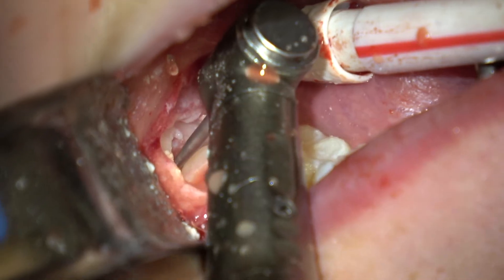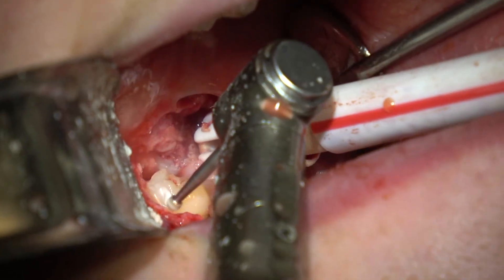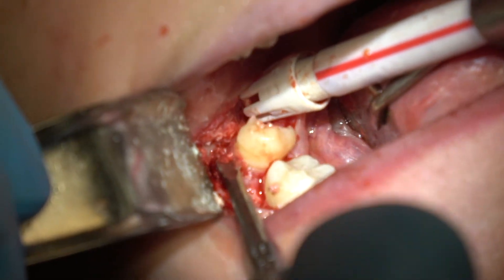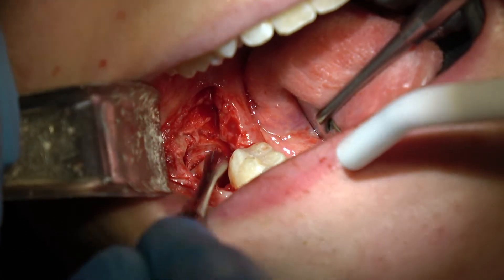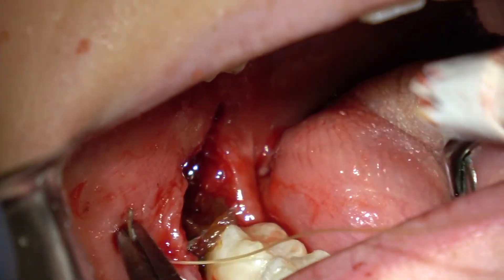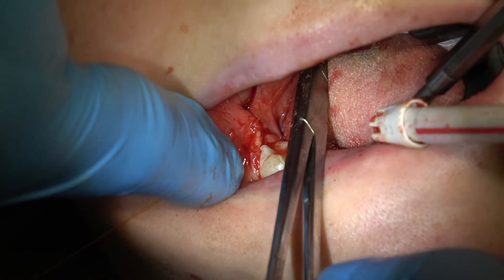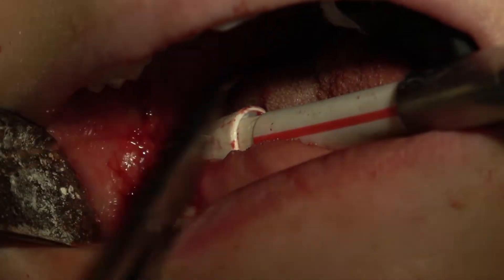Be very mindful of the inferior alveolar nerve. I'm protecting the airway here and that part comes out nicely. Then I'm creating a little space on the mesial facial — cutting into the tooth so I can place my elevator and roll it out. Don't cut the bone, cut the tooth. Here it comes, I'm protecting the airway. I've got a little bit of that distal root — sometimes the coronal part will fracture off the root and you need to go in and roll that out. Then I'm placing our packing in the socket after irrigating it well. Be sure you remove the follicular sac and then suture with 3-0 resorbable gut suture — one stitch just distal to the second molar and one a little further distally for a nice tight closure.